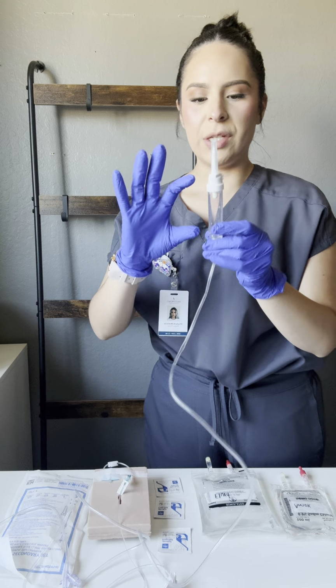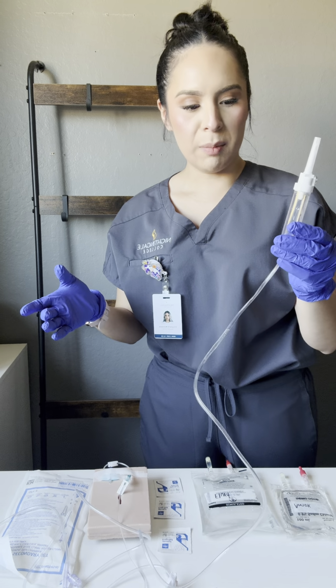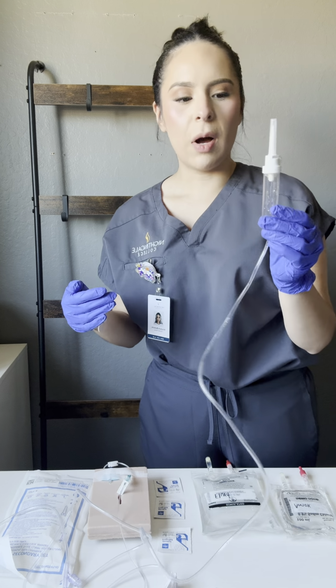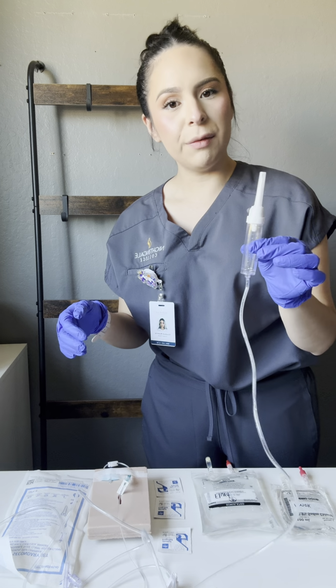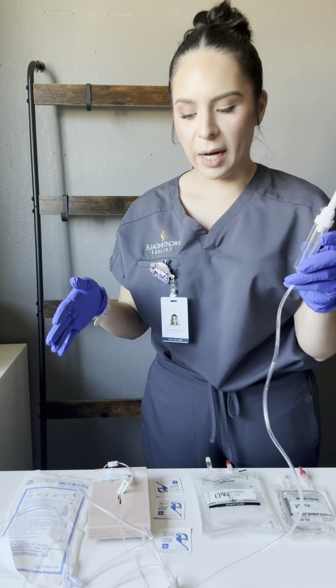And then this part here is called the drip chamber. The drip chamber prevents any air from getting into our line. It also helps us visualize our flow rate, and we want to make sure that it's at least halfway filled by squeezing it before we prime our line.